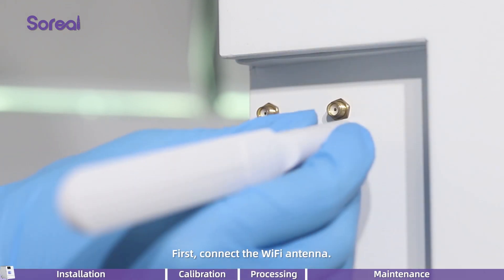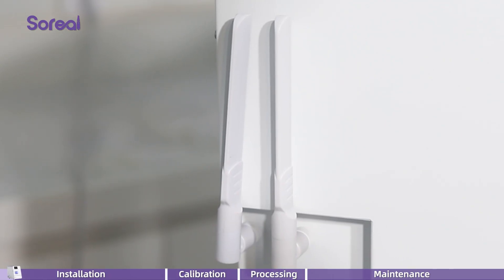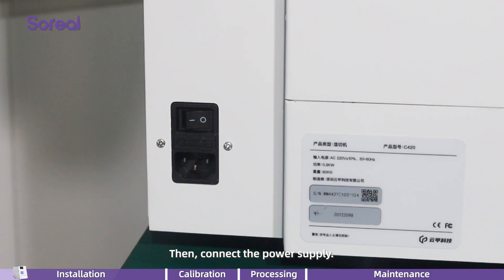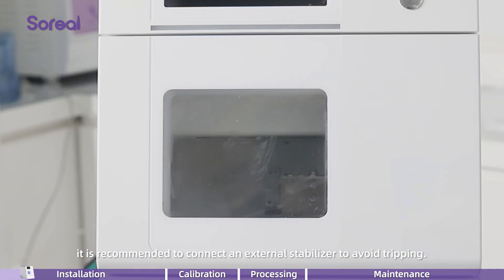First, connect the Wi-Fi antenna. Then, connect the power supply. If you are connecting three or more devices, it is recommended to connect an external stabilizer to avoid tripping.